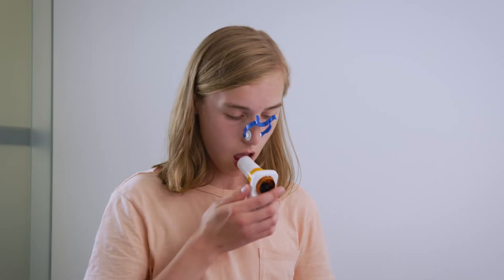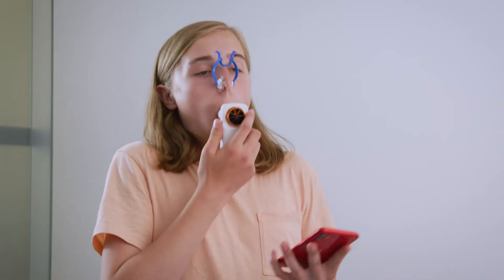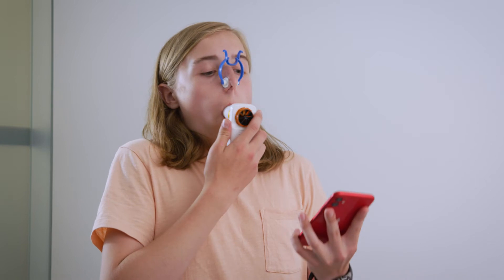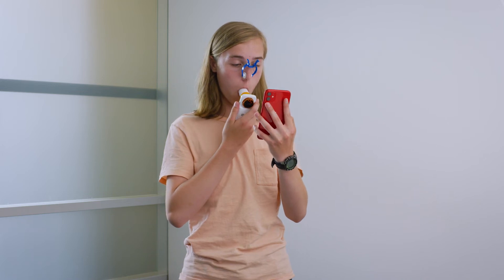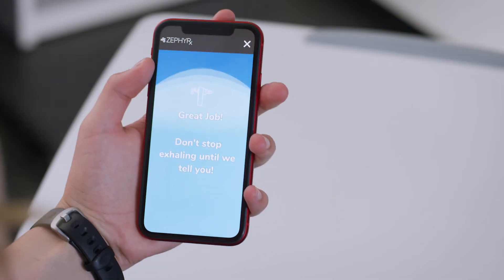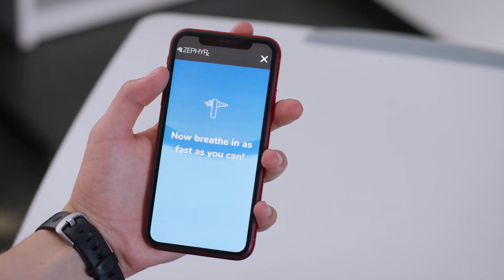Stand or sit with good posture. Put your lips around the mouthpiece. With your lips sealed around the mouthpiece, take a deep breath all the way in until you can't breathe in any more air. Now blast out the air in your lungs as hard and fast as you can. Keep going until the app tells you to stop and you hear a ding, or you can't breathe out any more air.